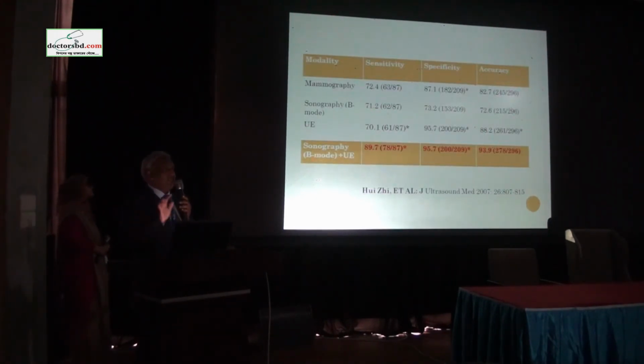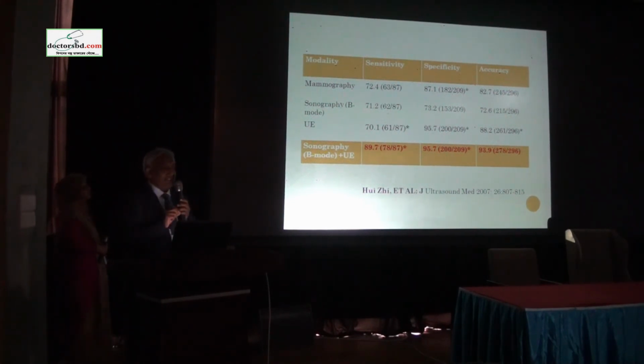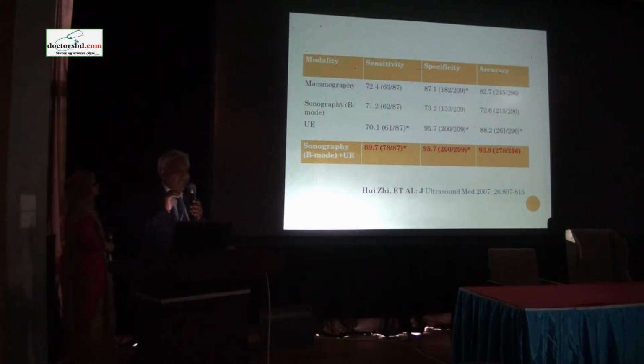So on the basis of their study, Huisi et al. have followed their study and have done a representative study on the basis of color elastogram comparing the mammogram, sonography, grayscale ultrasound and elastography.